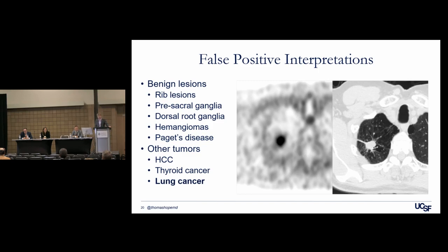Other tumors, and particularly lung cancer, have uptake on PSMA PET, and they have really good uptake on PSMA PET. It doesn't look low level, so SUVs in the 10s. You can see here on the PSMA PET image, it looks very avid. But this one's obviously fairly straightforward. It's spiculated, doesn't look like a cannonball MET like you'd expect from prostate cancer.